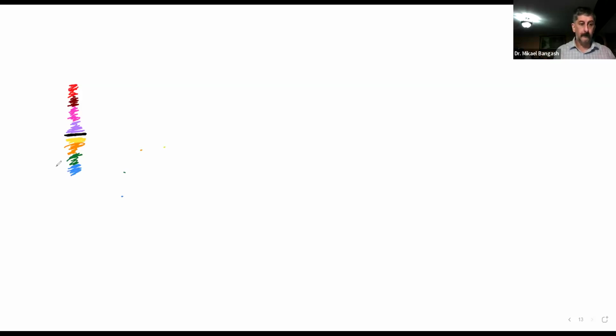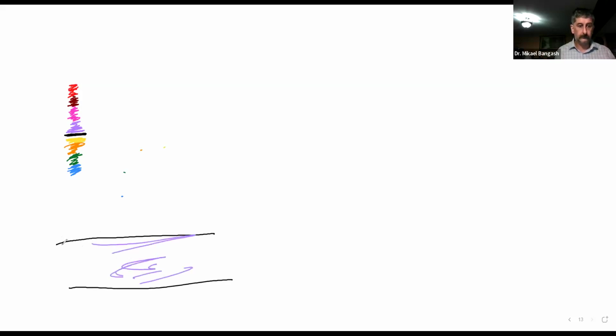Now, in this case, what is it that we may have? Let's say that we had a positive Doppler shift. Let's put all the colors of the positive in there.